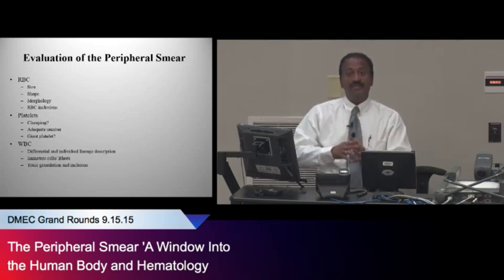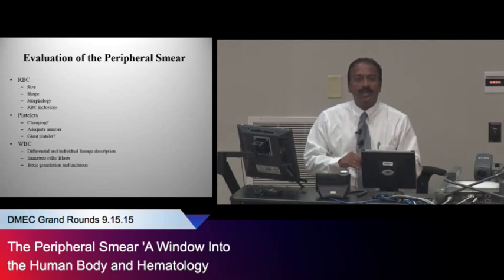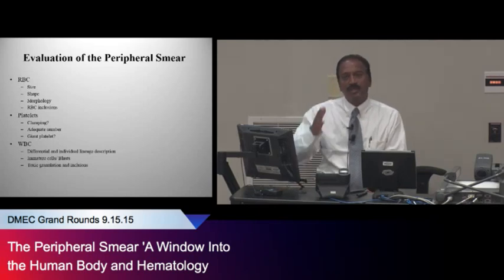I'm going to eyeball it and say 55%. Same thing with the peripheral smear. You're in a rush to see, is there a blast? Is there a schistocyte? Oh my God, do I need to call someone else? Do I need a bone marrow biopsy? And my philosophy is to follow an orderly sequence.